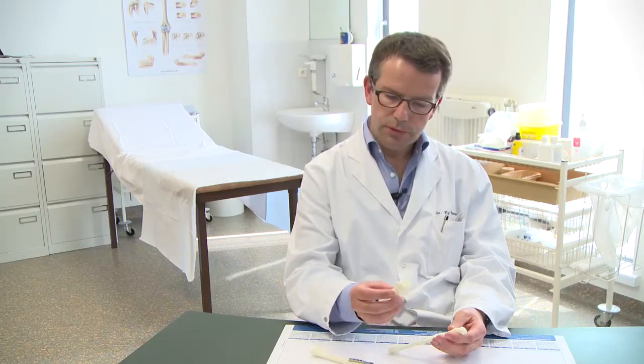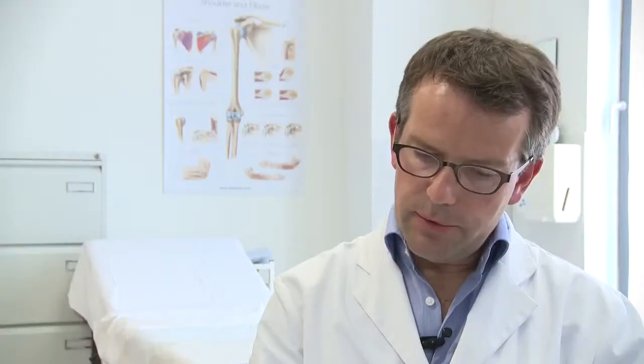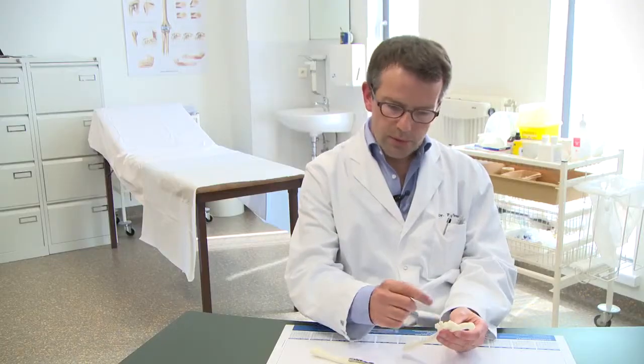Dr. Verstreiken stresses the importance of very close collaboration between a surgeon and a clinical engineer. The engineer designs the patient-specific guides, which are 3D printed and sterilized. During surgery, the guides are placed on the patient's bones and fit like a glove on the exact spot they are designed to go to. Once a guide is in place, the hardest part of the surgery is over.